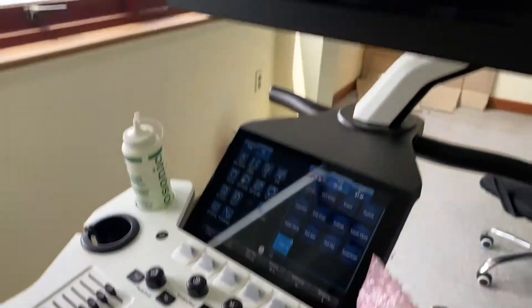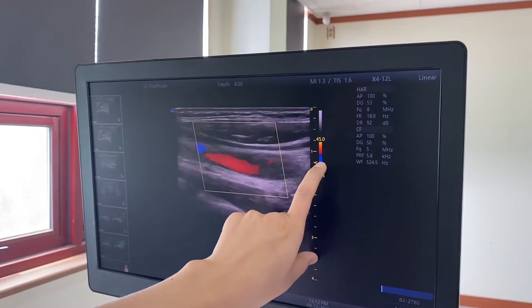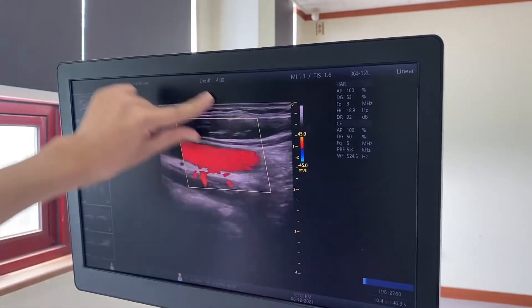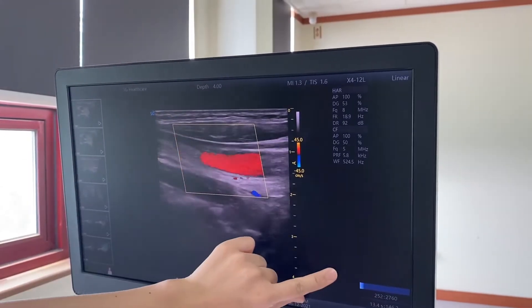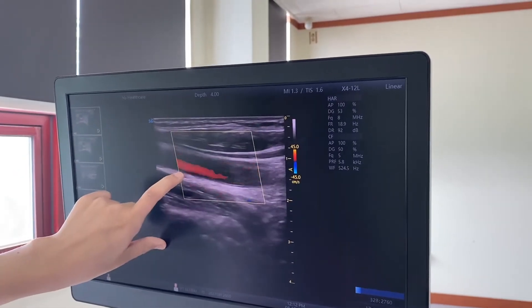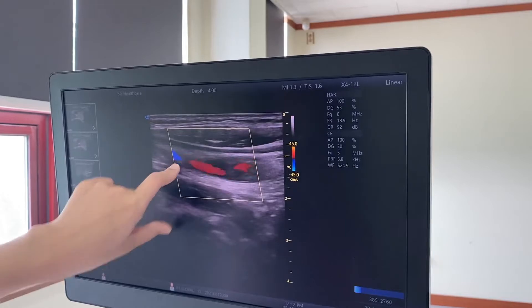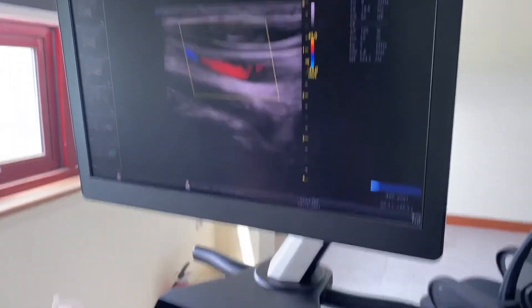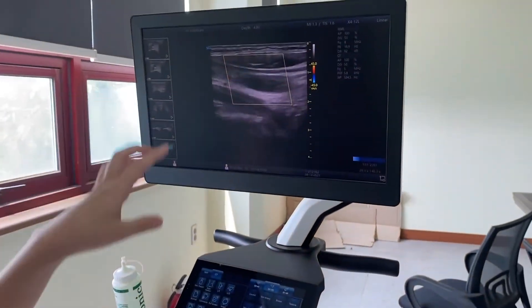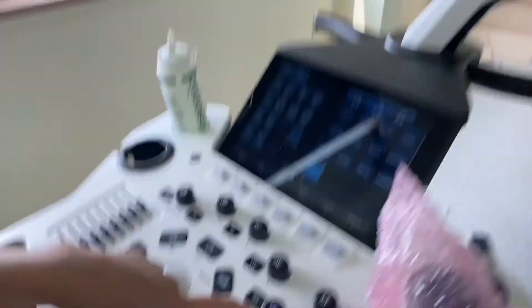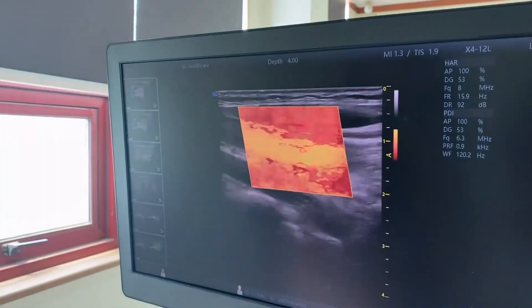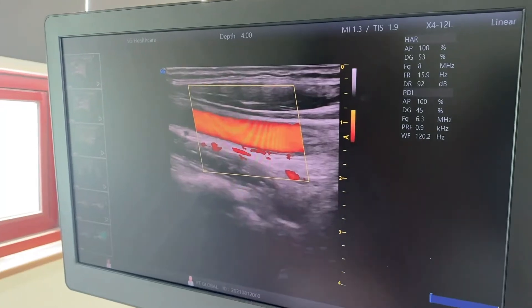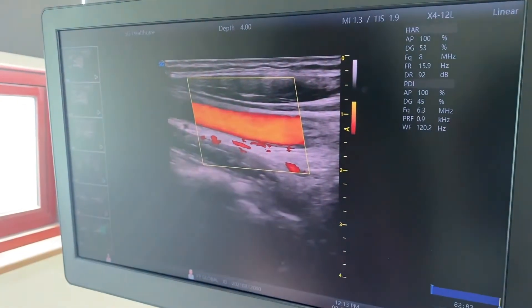In Color Flow, red means blood flow toward the probe, and blue means the direction is away from the probe. So with Color Flow you can see vascularity and the direction of the vessel. With PDI (Power Doppler Image), there is only one pattern — orange — showing only vascularity with no directional information, but it is slightly more sensitive than Color Flow.